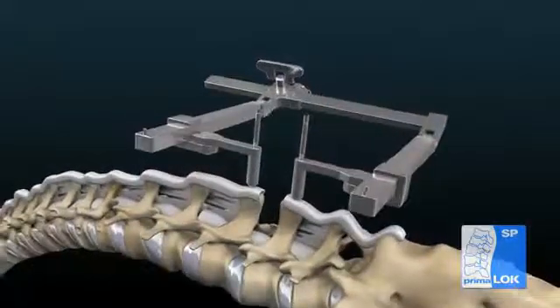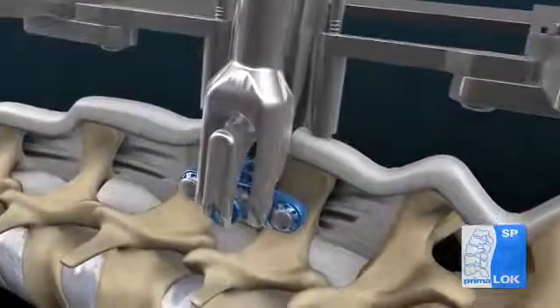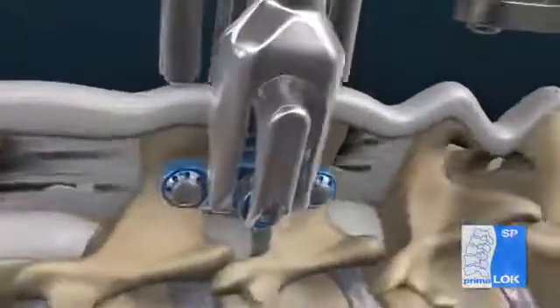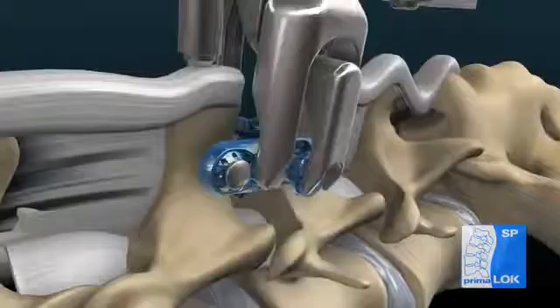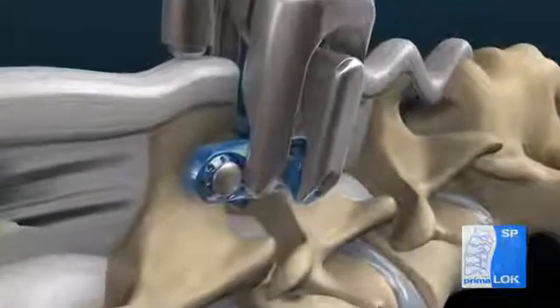With the implant secured to the inserter, lift from the caddy and place into the interspinous space as far anterior and close to the lamina as possible. Gently squeeze the inserter to compress the implant plates together, seating the teeth on the grips into the bone.